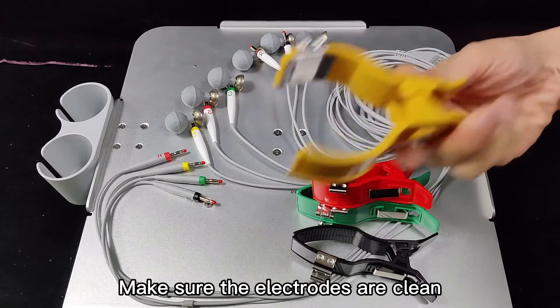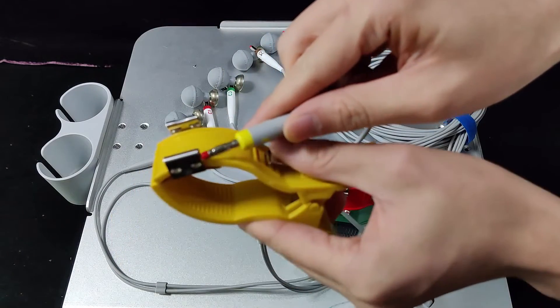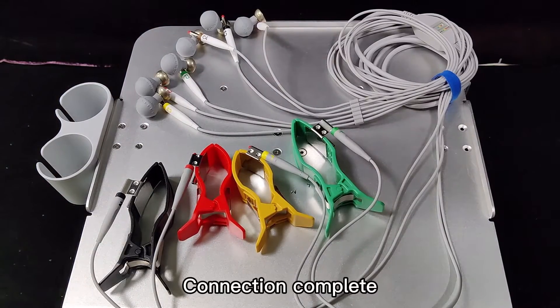Make sure the electrodes are clean. Insert the electrodes into the electrode sockets according to the color. Yellow corresponds to yellow. Connection complete.